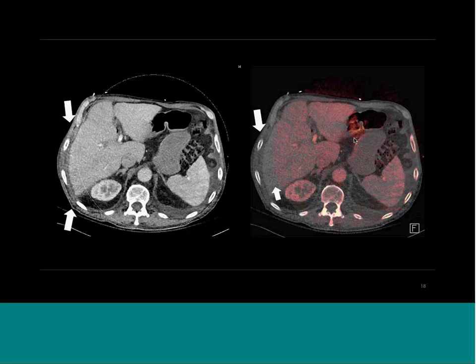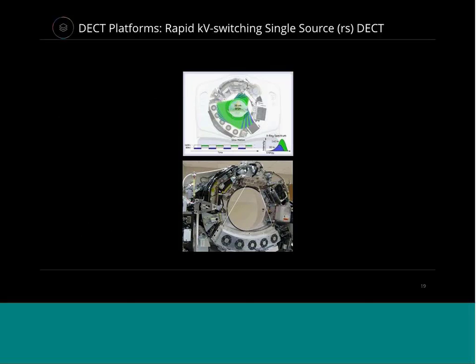This is an iodine overlay. You can only get iodine overlay for those areas that you scan in dual energy. Otherwise, everything outside of this dual energy scan field of view is single energy. So you can see a clear circular demarcation. I don't know if you guys are able to appreciate that on the projector. But you can see that there's this nice demarcation between where the iodine starts and stops, right? And everything scanned here is with the lower kVp, okay? So here we can't get any dual energy CT information. Moreover, the image quality isn't great. You guys stop me if that doesn't make sense.